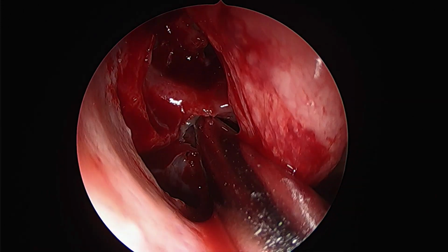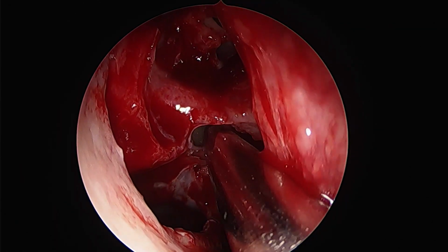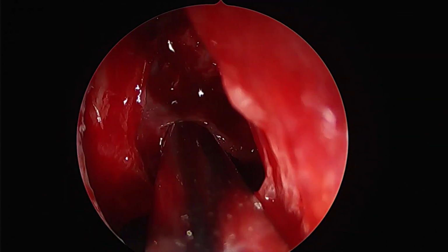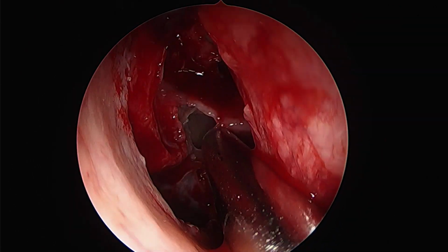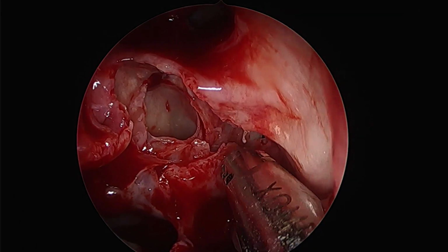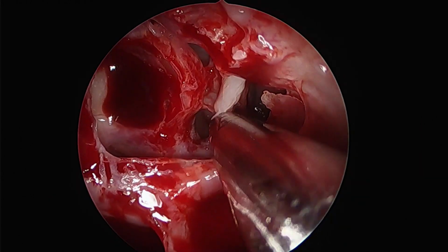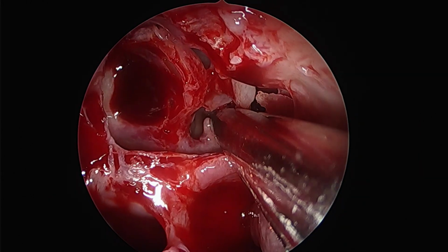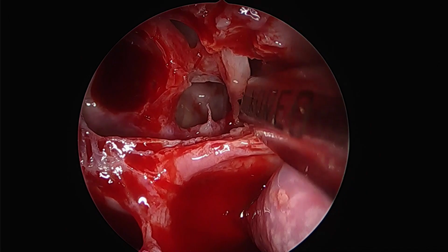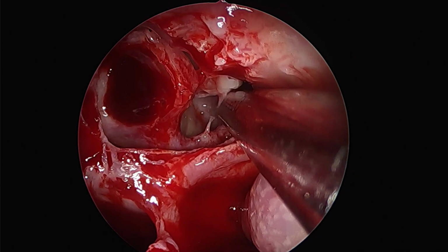So once the antrostomy and the anterior ethmoidectomy have been done, we are now going past the basal lamella into the posterior ethmoids. As of now, the meningocele is not visible yet. It should be soon visible. A generous removal of all the cells is very important to identify the skull base in its entirety, right from the frontal sinus to the sphenoid planum. We take off a portion of the superior turbinate as well, the inferior half.